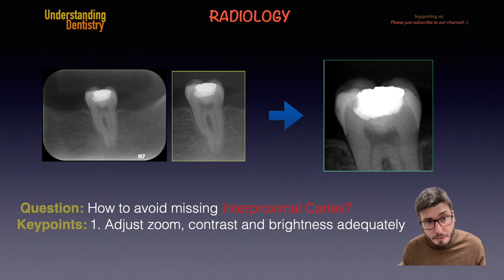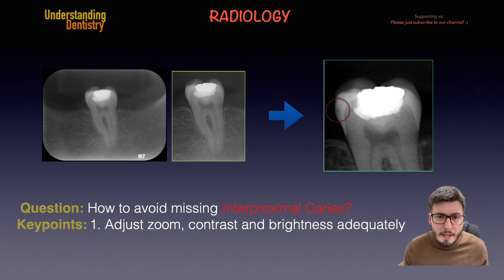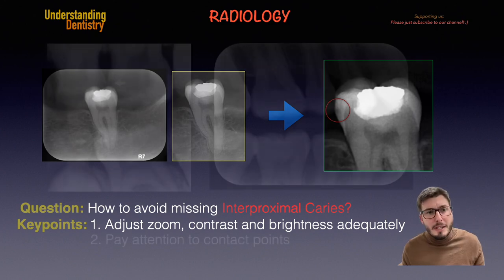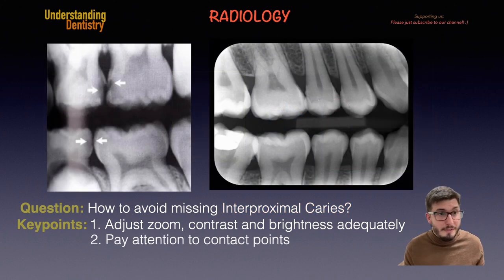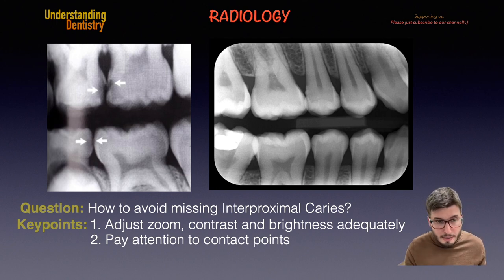On the left side of your screen it's more challenging to see, but on the right side we can actually see the interproximal caries because we have enhanced the contrast and brightness. If we see more advanced caries with dentin involvement, then it's even easier. This leads us to the second key point.